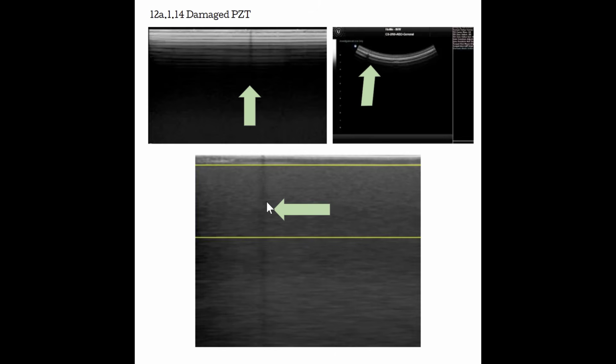So you need to be very careful with your transducers, take care of them, make sure you don't bang them around or drop them on the floor. And then the other way that the channel can become damaged is by rolling your machine over your cord. Remember, all those wires connecting to the crystals have to travel through the cord and back to the machine electronics.